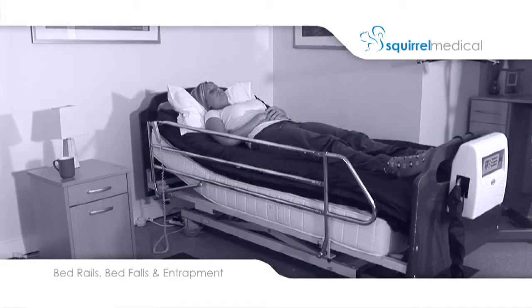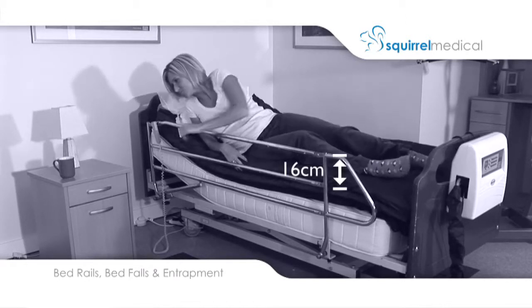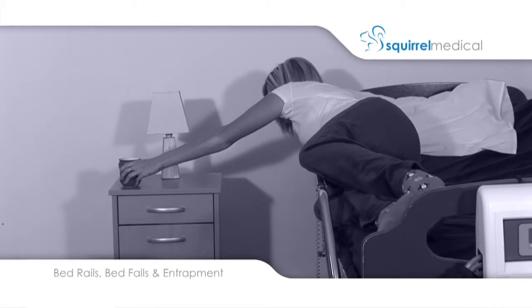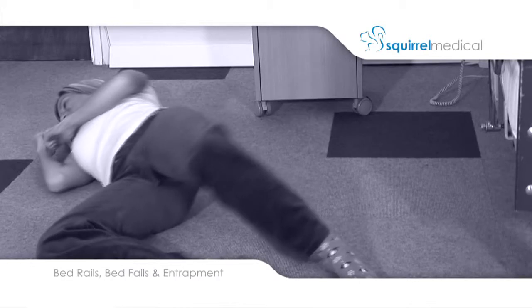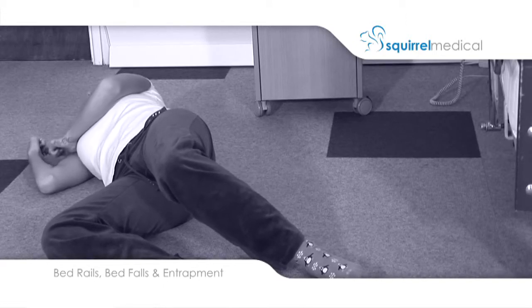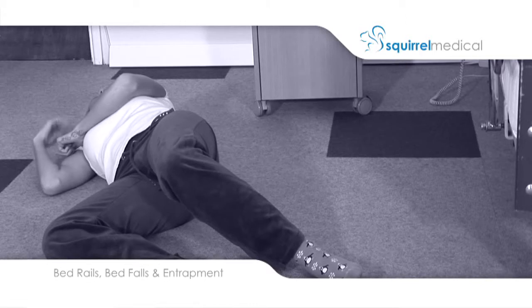Julie needs some water. She is resting on an alternating air mattress and has been provided with bed rails which are clearly inadequate and are just 16 centimeters above the height of the mattress. As she becomes more determined to reach for her water, she moves closer to the edge and finds her fulcrum. This results in a serious bed fall. Of course, we are using an actor, but for someone that is aged and frail with an underlying health risk, this fall could be fatal.